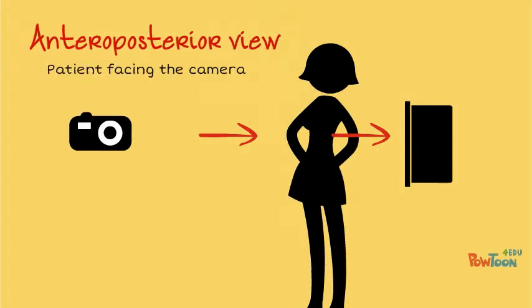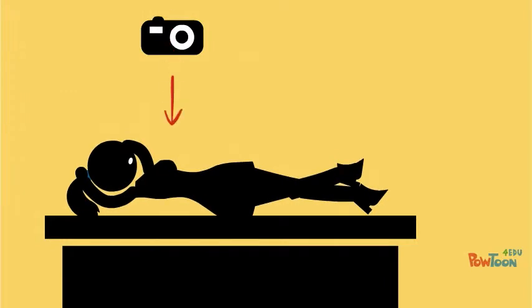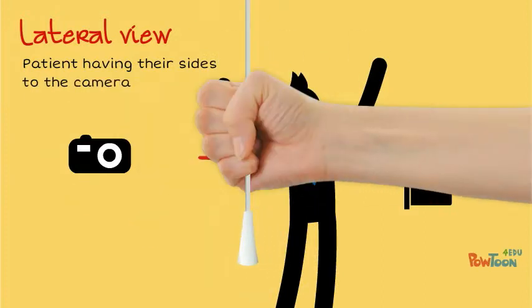When the patient can't stand or the particular view requires it, the patient is positioned on an X-ray bed into which the film is placed, and the emitting source is swiveled to place it accordingly. There is also a wide range of specific views that the radiographer captures to investigate particular pathologies.